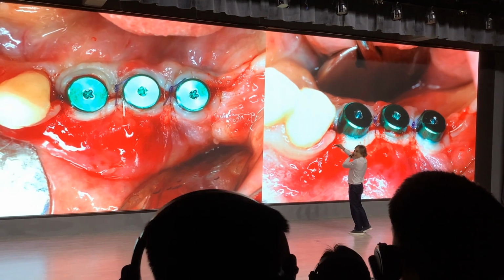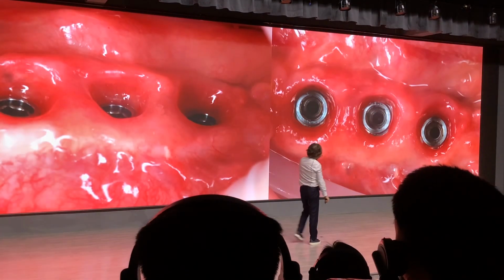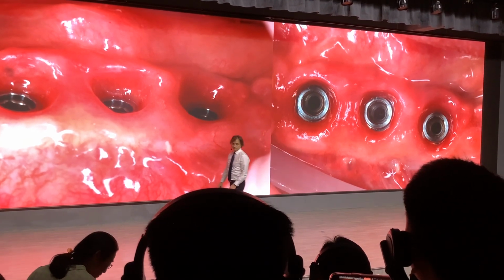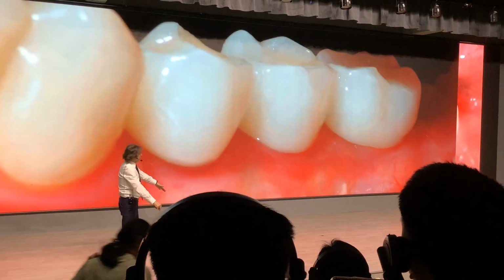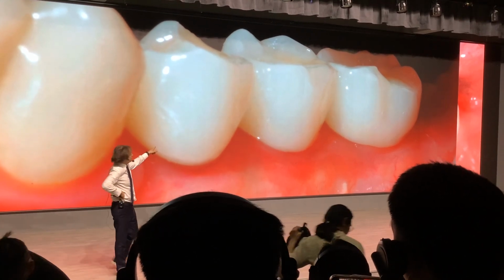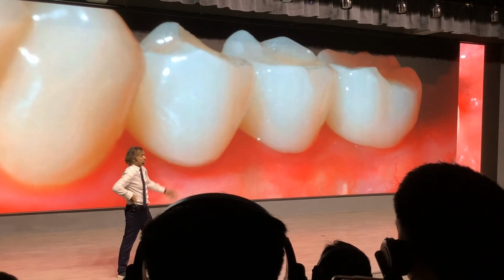So now you have keratinization of the lingual, keratinization of the buccal, and see, it's beautiful. You have keratinized tissue everywhere. There is no problem with the vestibule because once you bring the bone up, there's no problem. Then there's 3 crowns. And if I show you this patient, you think no bone graft was done here, no defect. It's like normal teeth.